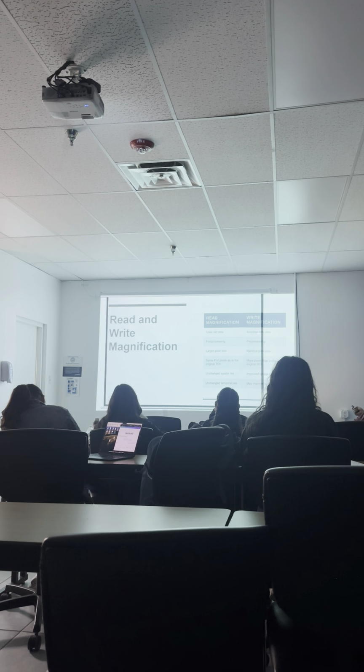Okay, now write magnification. It requires new data. It is pre-processing, identical pixel size, more pixels than in the original region of interest, improved spatial resolution, and may improve temporal resolution. Why do you think you would improve temporal resolution?